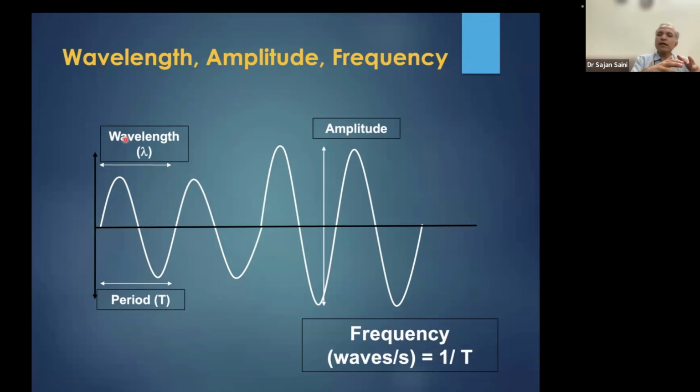To overcome that, you need ultrasound waves with higher frequency. So if you want to interrogate superficial structures, we want ultrasound with a higher frequency. And if you want to interrogate deeper structures, we want ultrasound with the larger wavelength and consequently lesser frequency.